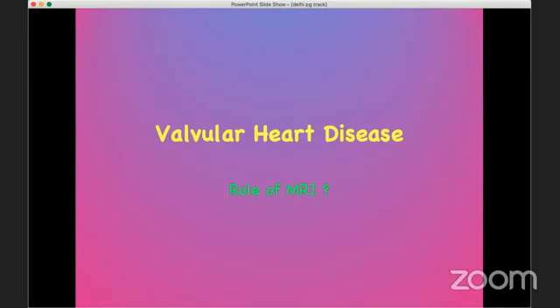ejection fraction evaluation, volumetric evaluation, and scar analysis are all the important components, and obviously ischemia using either adenosine or dobutamine. These are the four major components that MRI looks at in coronary artery disease, and this helps us fine-tune our therapy when we manage these patients.